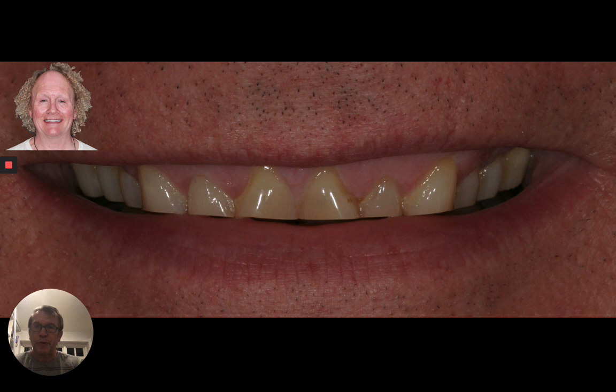This is the patient, Paul, and you can see he has pretty worn teeth. So we'll talk a little bit about the diagnostics that go with this. It's always very important. But more importantly for this course, we're going to be talking about how we can use digital technology, first of all, to motivate and engage the patient to move to the next phase to find out if they're interested. So we're going to be talking about a little bit of 2D smile design. Shemik's going to walk you through how to do some simple two-dimensional smile design that you'll be able to do in 10-15 minutes quite easily to give the patient an idea about how this might look.